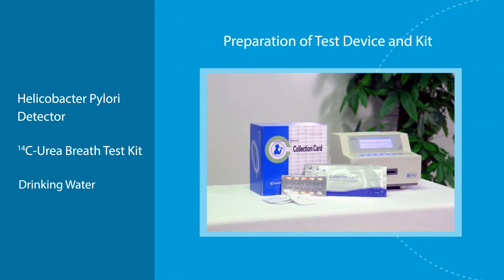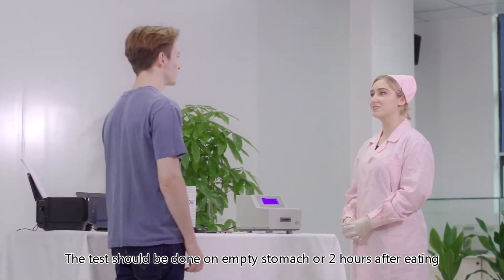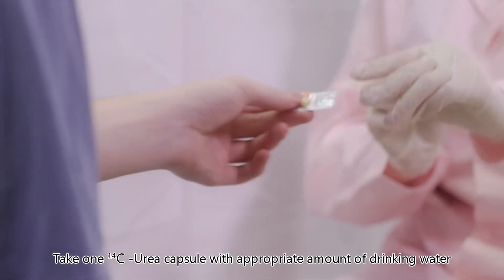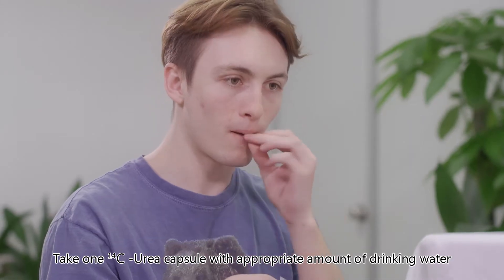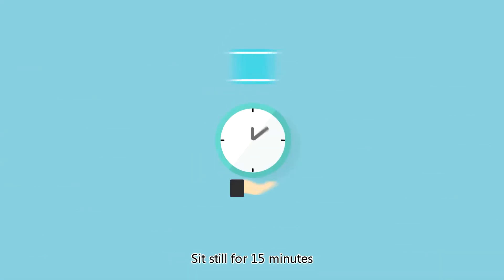Preparation of test device and kit: Helicobacter pylori detector, carbon-14 urea breath test kit, drinking water, and sample collection card. The test should be done on an empty stomach or two hours after eating. Take one carbon-14 urea capsule with an appropriate amount of drinking water and sit still for 15 minutes.